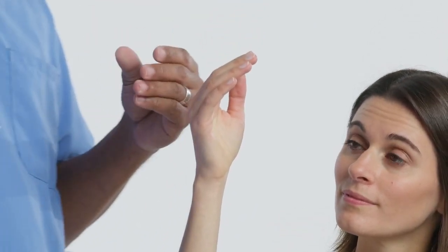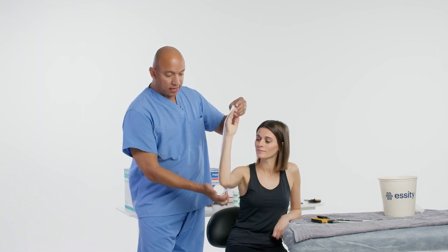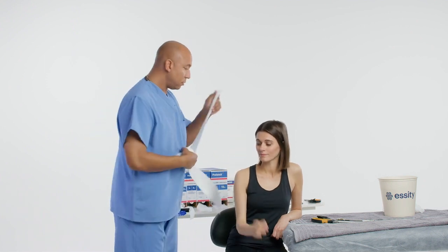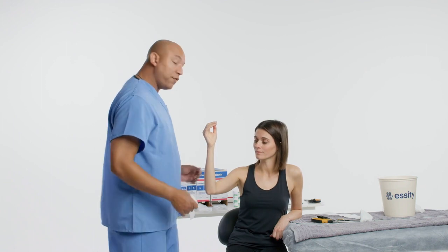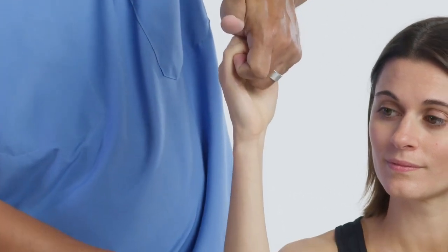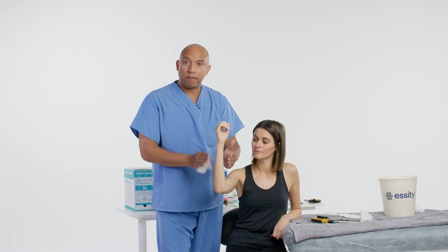We'll measure on the uninjured extremity to lessen any discomfort to the patient. Make sure the patient's at 90 degrees, go around the elbow — that's our measurement for our splint. Now let's pad the patient. The person applying the splint should be in front of the extremity. If you have an assistant, they need to hold the extremity in what we call a JJ hold. If you need counter pressure, place your hand on mid humerus and distract the wrist to keep the bone in better alignment.